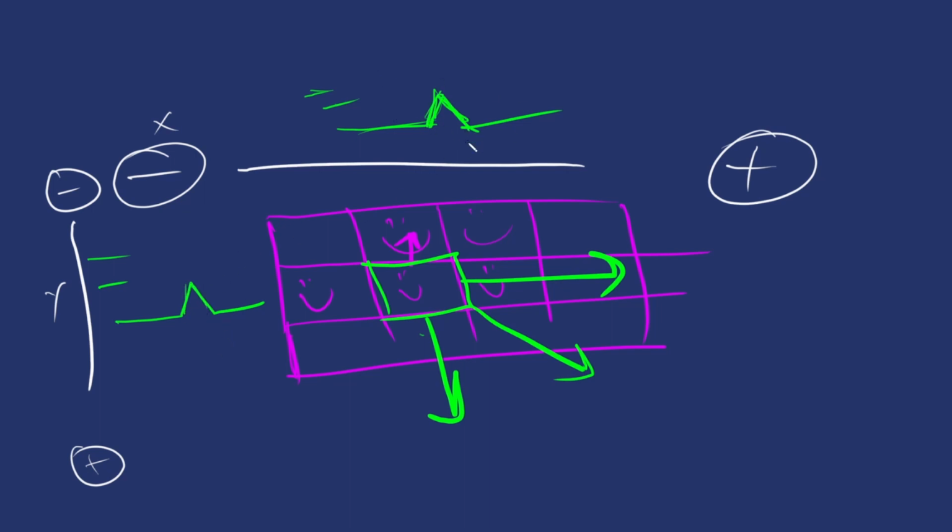But now using this, if we were to look at this, we can see it has a positive deflection. We know that this signal is going towards the positive this way. And we know with this one, the signal is going towards the positive this way. And this here is the basis to the next concept, which is the electrical axis. The electrical axis is just a form of exactly what we just did, placed basically on a grid.